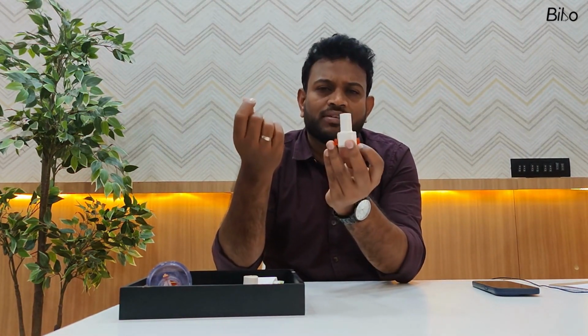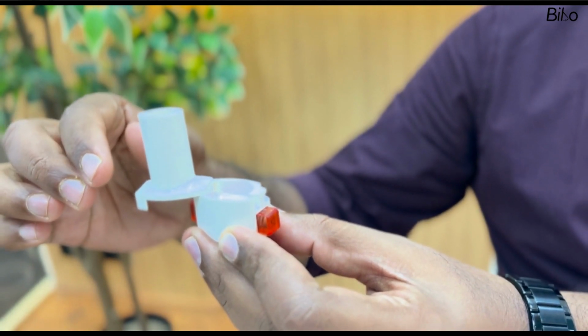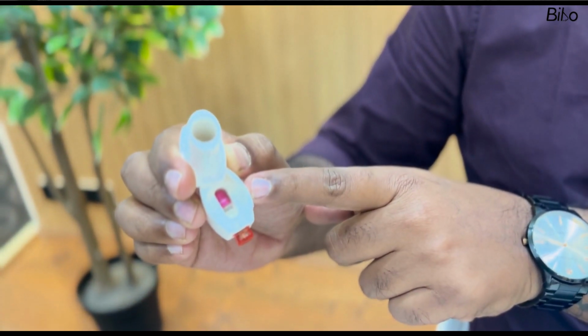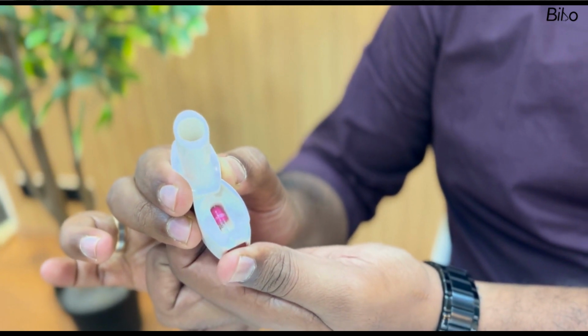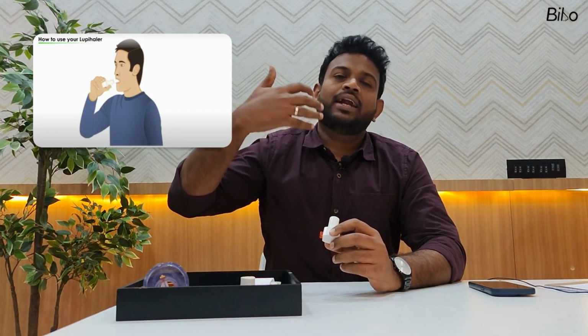This is a small device, this is the capsule. We have to open this and then place the capsule inside, then close this chamber. These are the two knobs. By pressing them, the capsule will be broken and the powder will be released into the chamber. Now what the patient has to do is put this into the mouth, close the mouth, form a tight seal on the inhaler, and then inhale deeply and hold the breath this way.